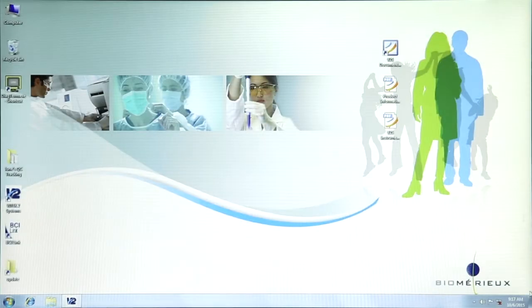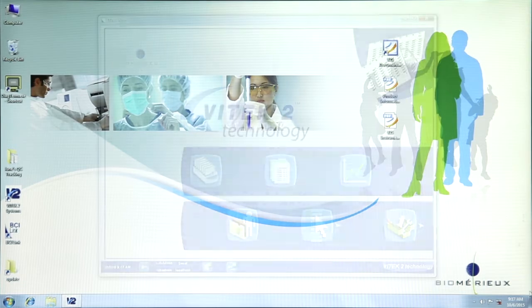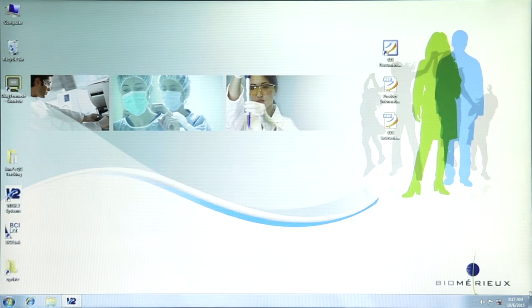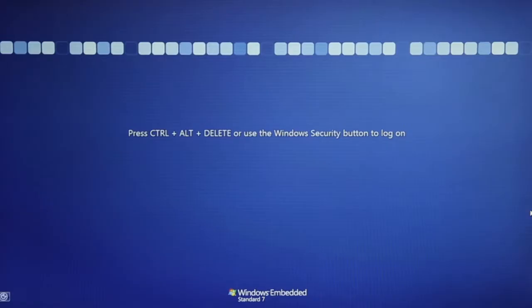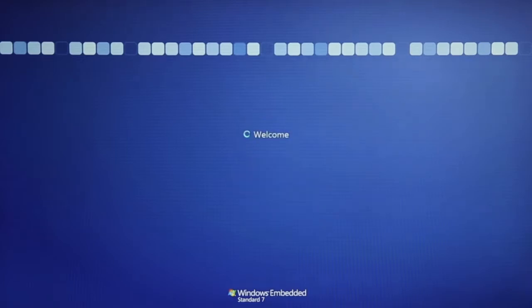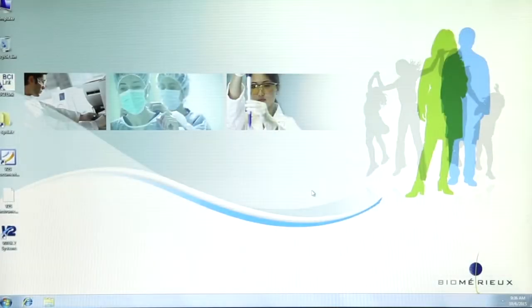There are two main types of software on the Vitek 2 system's computer: Windows and the Vitek 2 system software. The Windows software is the base operating system that runs and manages the computer. The user must first log on to Windows in order to gain access to the Vitek 2 system software. Please note that this video is specific to computers with a Windows 7 operating system.